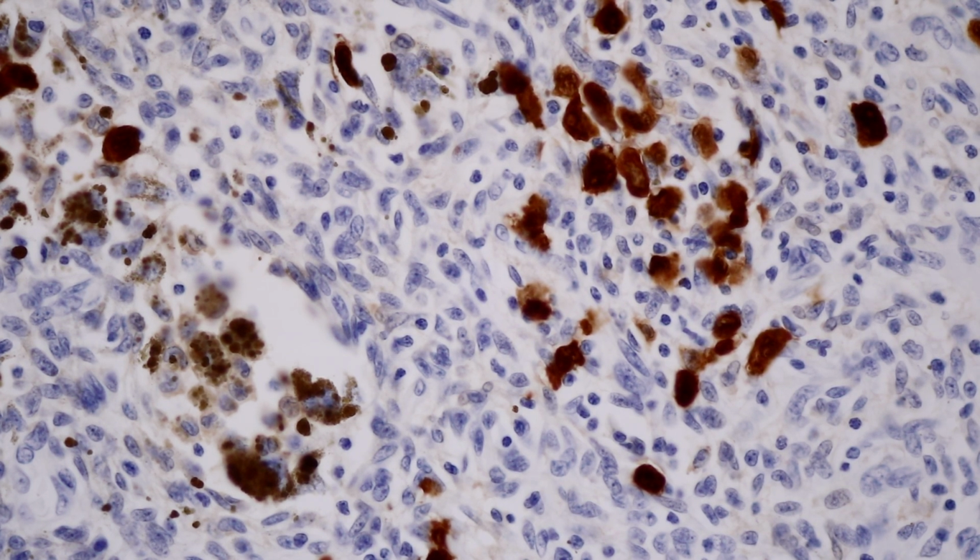SOX10 might be a better choice if you're looking at something and thinking, is it dermatofibroma that's got a bunch of hemosiderin versus some sort of melanocytic neoplasm that's making a bunch of melanin. I would say SOX10 might be better in that setting because it would avoid this problem here.